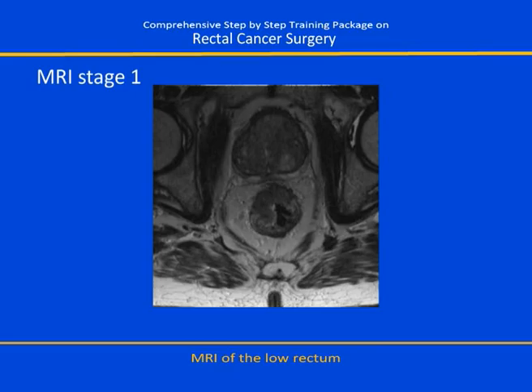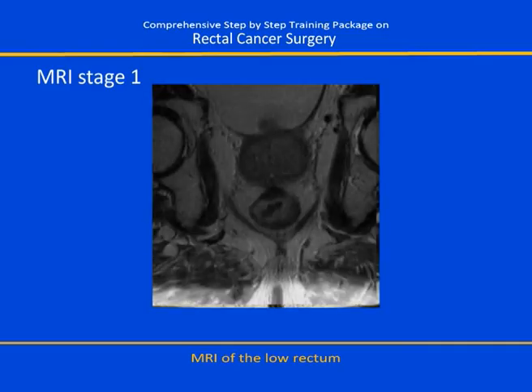At the level of the prostate, the tumour is infiltrating anteriorly, but there's a clear millimetre between the anterior invasive edge of the tumour and the mesorectal fascia. The patient was given preoperative chemoradiotherapy because of the proximity to the fascia, and you can see here there's fibrotic stroma that's replaced the tumour signal, and there is now definitely a clear margin anteriorly.